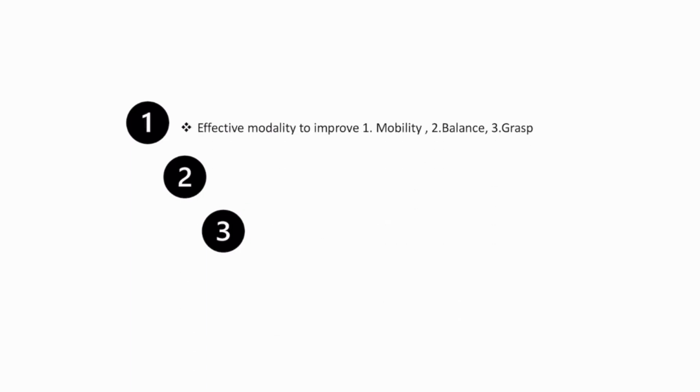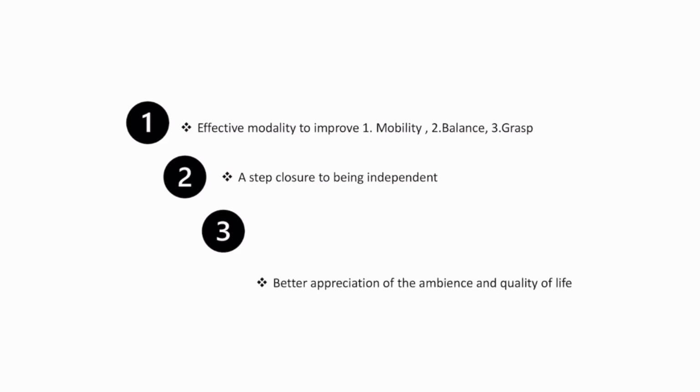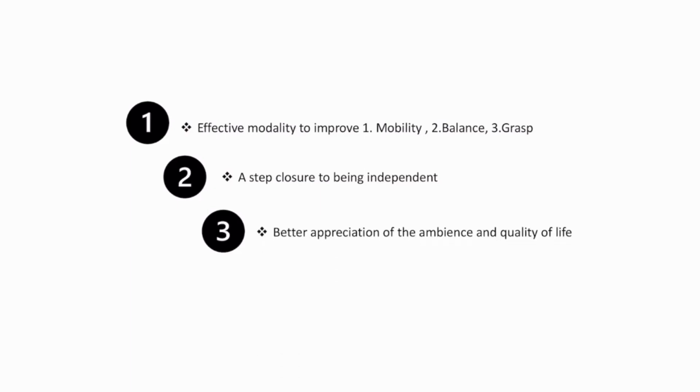Thus, yoked prisms can be an effective modality to improve mobility, balance, and grasp by improving visual perception in children with cerebral visual impairment. This takes them a step closer to being independent and provides them with better appreciation of ambience and quality of life.